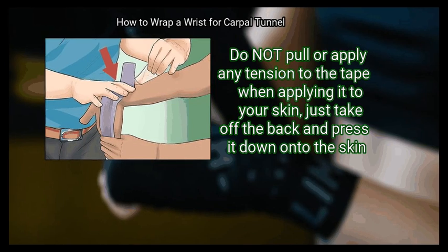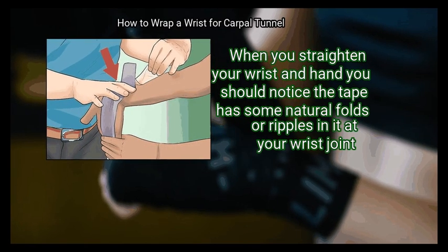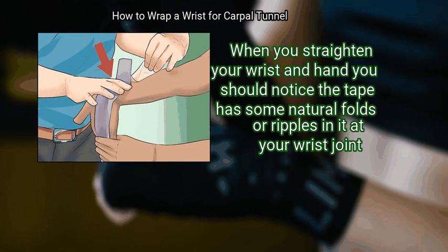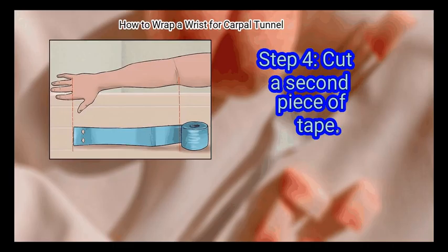Do not pull or apply any tension to the tape when applying it to your skin. Just take off the back and press it down onto the skin. When you straighten your wrist and hand, you should notice the tape has some natural folds or ripples in it at your wrist joint. This is to ensure you still have full motion of your hand and wrist while the tape is on.